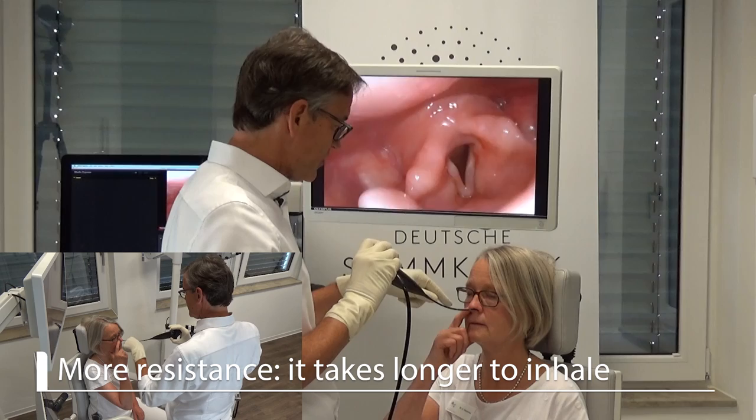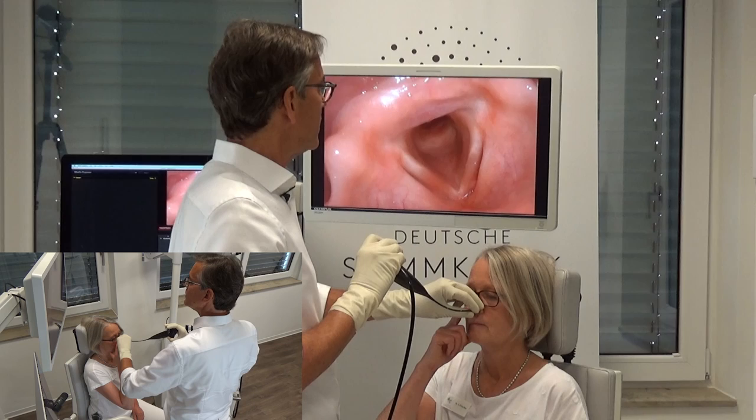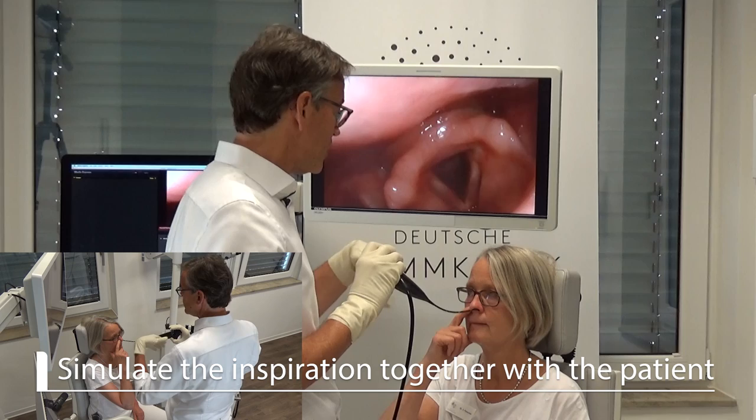So let's exhale through the mouth, and even if I squeeze a little bit here, give me a long inhalation through the nose so we can hear it. Very good, and exhale. I also sometimes help the patient and simulate the inspiration through the nose as well, so to do it together.